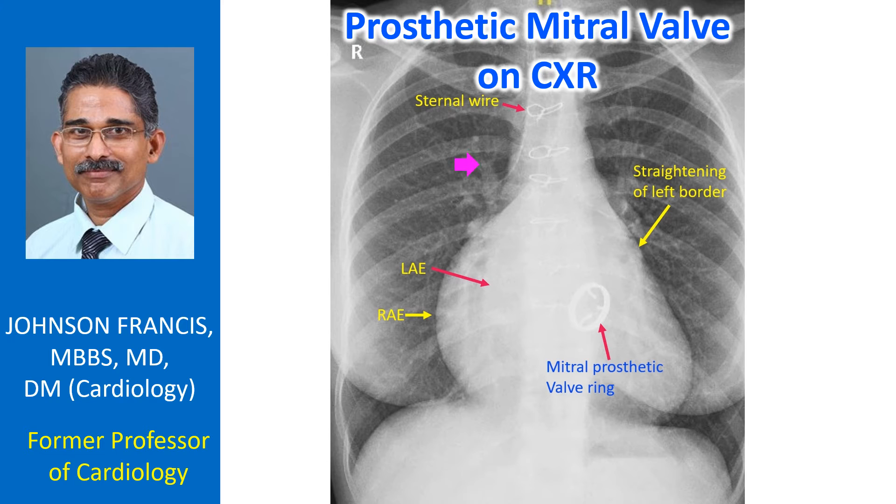Upper lobe vessels are prominent, possibly a residue of previous pulmonary venous hypertension.